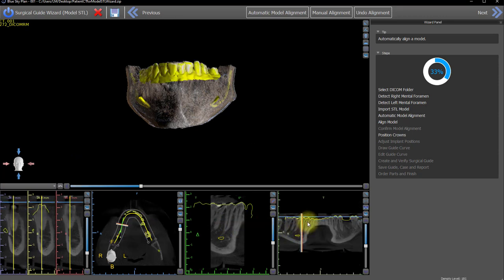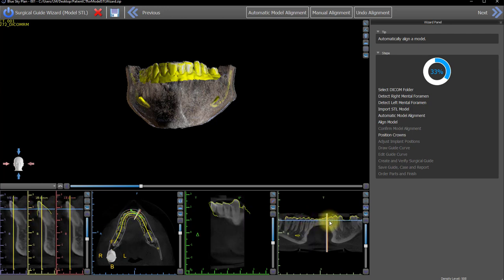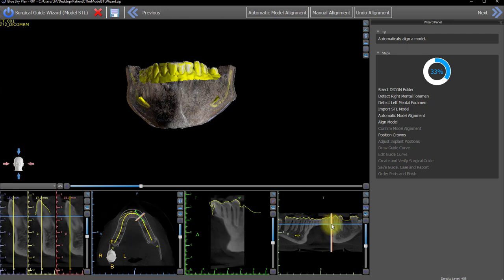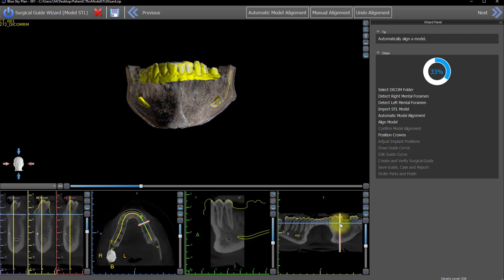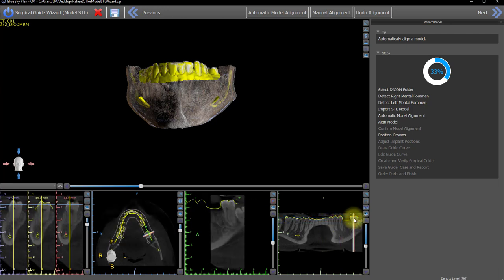In the panoramic, I can click on each of the teeth and look in the cross-sections to show the hint line around the teeth — that the model is snug against the outline of the teeth. And this is showing that the alignment could not be any better.